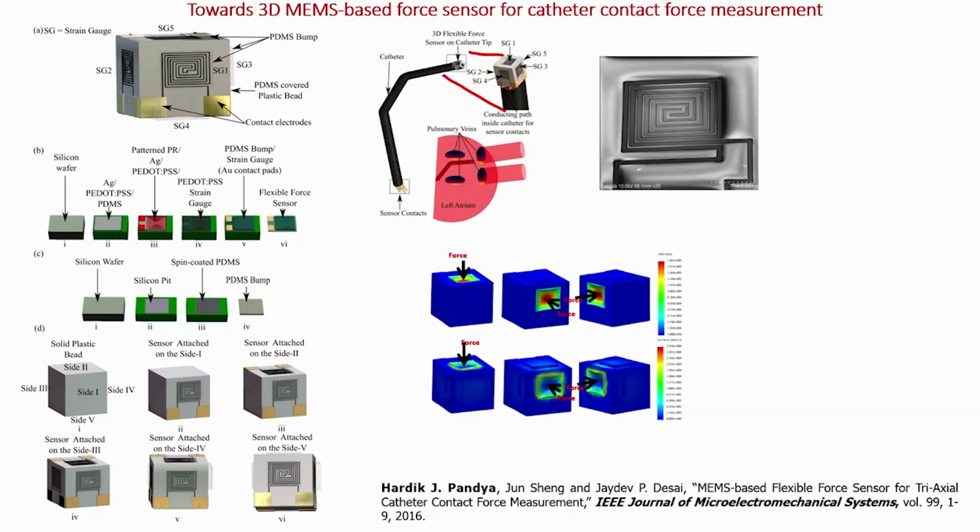And the gauge factor for metal is poor compared to the gauge factor of semiconductor. So, you need to understand that when you are fabricating a sensor, you need to understand which material you are using and what will be the effect on the gauge factor using that particular material.